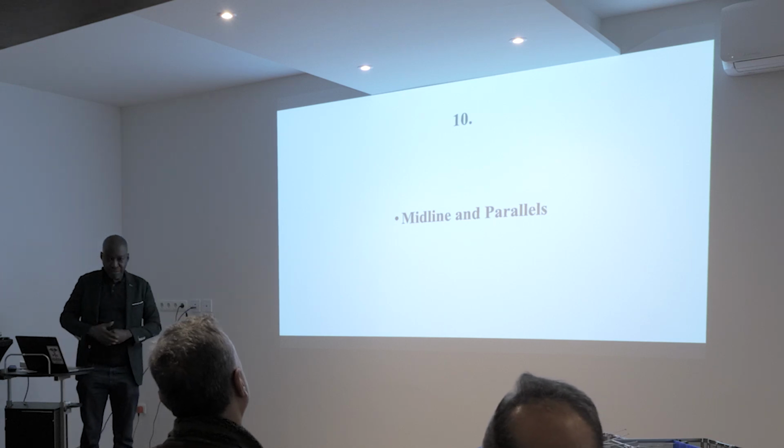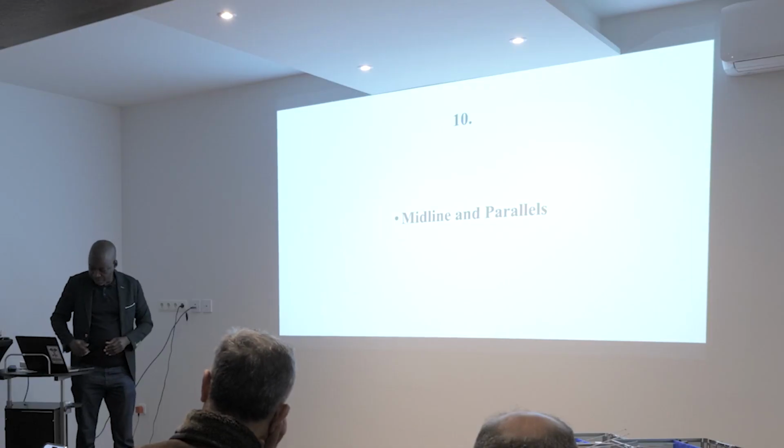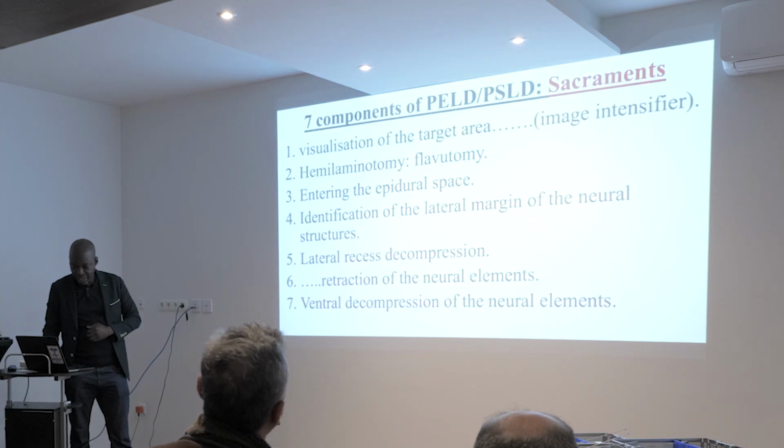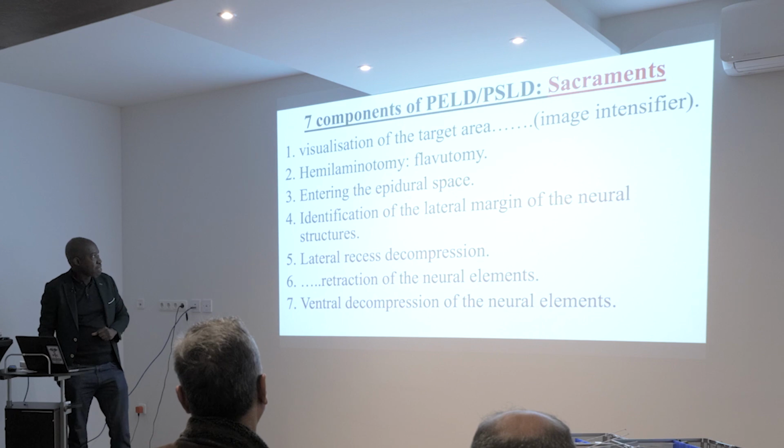Midlines and parallels: you have to know how to position your patient well, how to get the image intensifier, and how to get parallel end plates and the midline of the spinous processes. Then the 7 components of PELD.